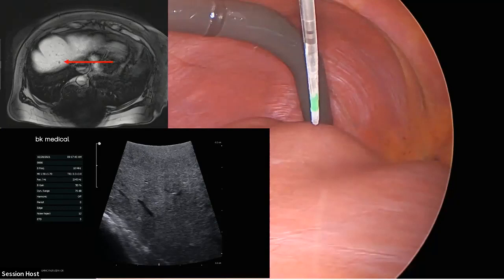So when you're doing a liver, if you pull out the ultrasound and you run through the anatomy in the same way every time, that helps you figure out what's normal, what's variant. Really quickly, you can pick out variants because you're used to seeing what a normal thing looks like. Same with pancreas, not to diminish the ugly stepchild. But for me, with ultrasound of the liver, I do it the same way every time.